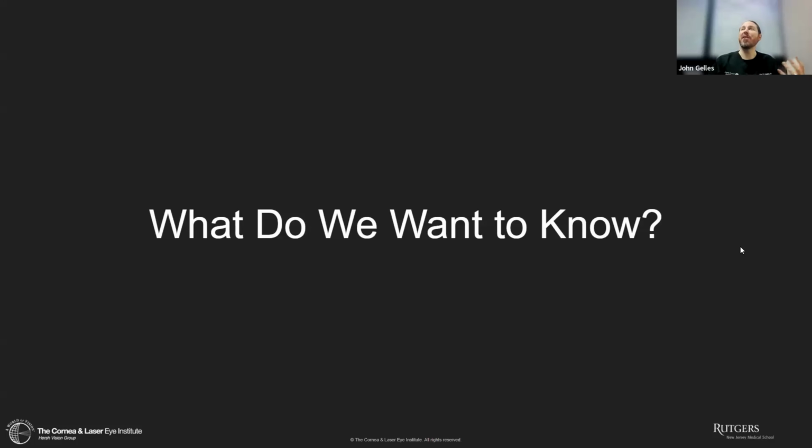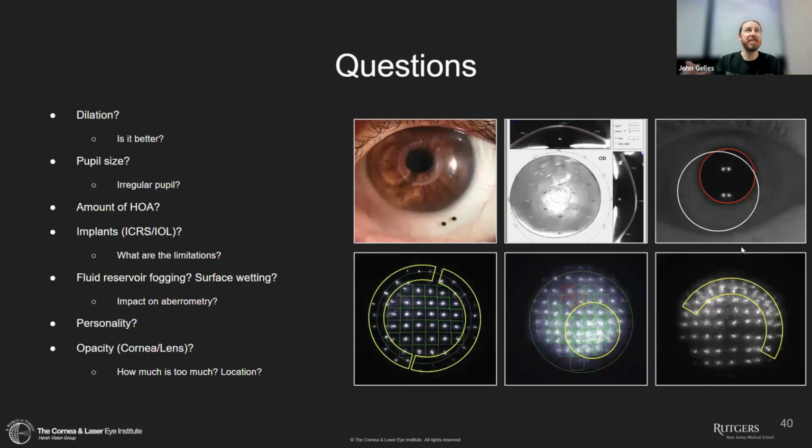Now, what do we want to know? These are the things that are outstanding and can be areas of research that we can look at. The question is, is dilation better than just physiologic, right? We don't know. My results, where we didn't actually dilate anybody in that prospective study, were pretty consistent with the studies that have been done previously where they did dilate them.